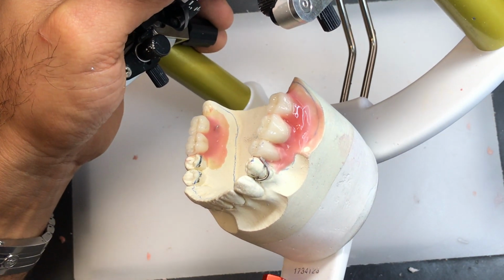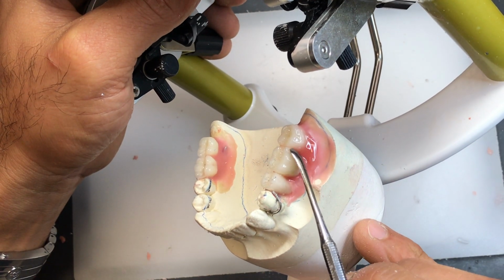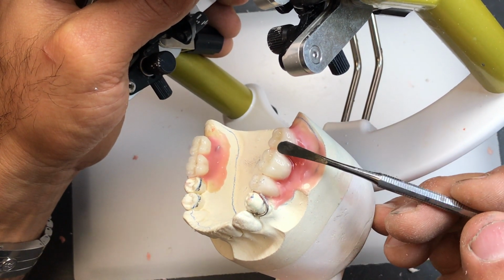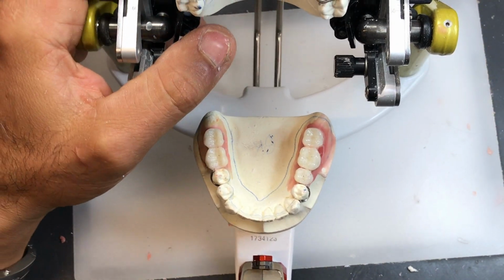Just want to make sure that I have a nice seal between the tooth and the wax. This particular wax is very hard, so it doesn't necessarily adhere to the tooth very well. So I got to get it extra hot.